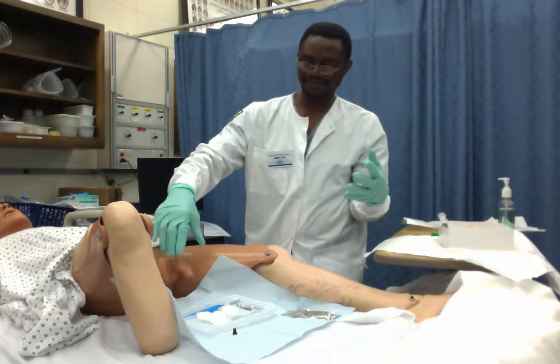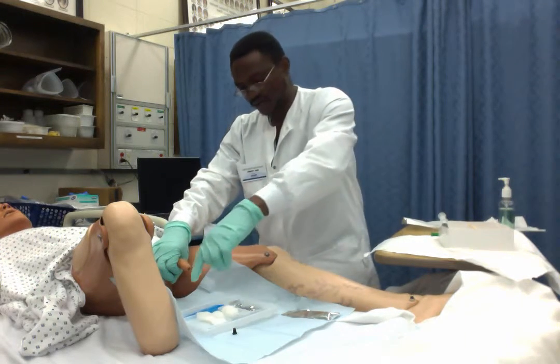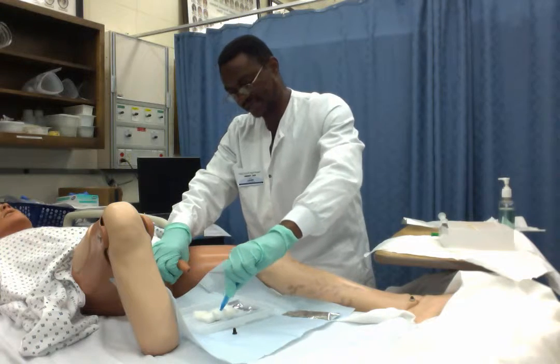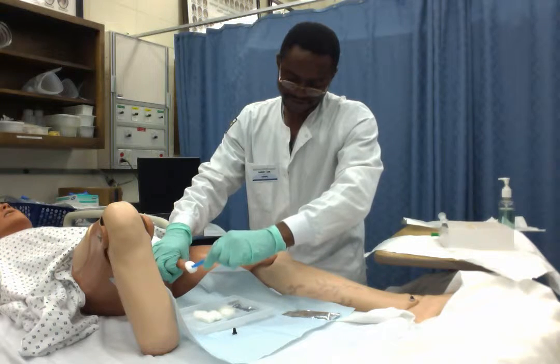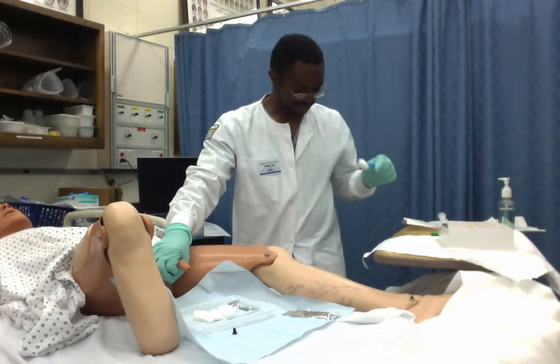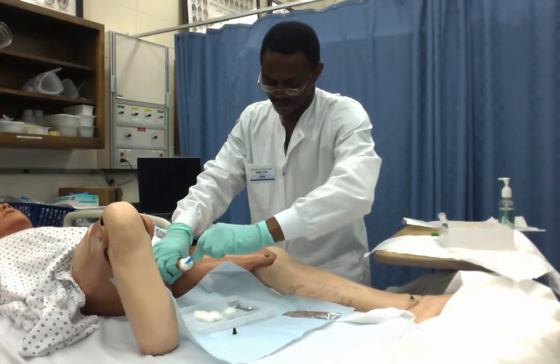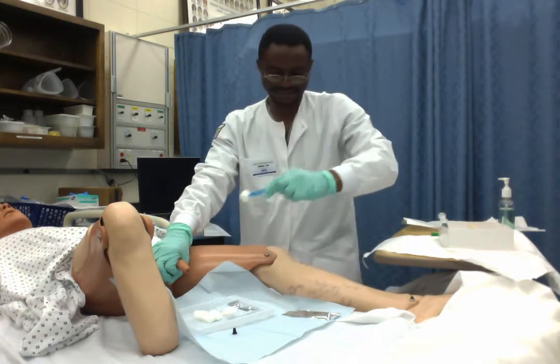So I can now grab the penis with my non-dominant hand and clean it with a cotton bud with a circular movement from the tip outward, once. I will repeat this procedure at least three times.